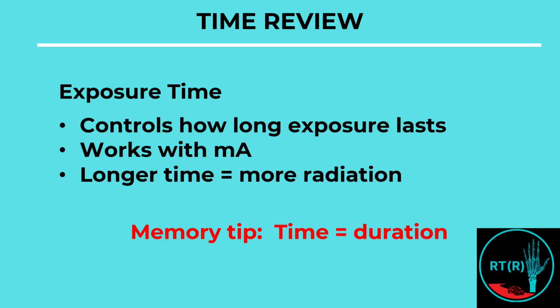Exposure time controls how long exposures last. Exposure time works with mA. A longer time equals more radiation dose. Time equals duration. The time determines how long the X-ray beam is produced. It directly affects total radiation when combined with mA.